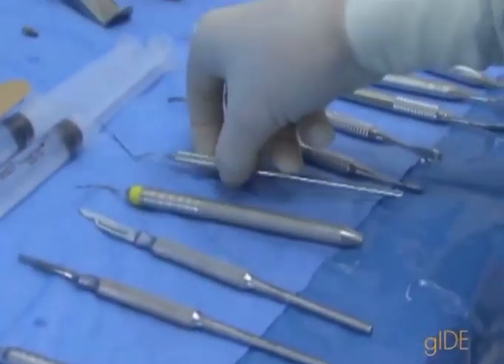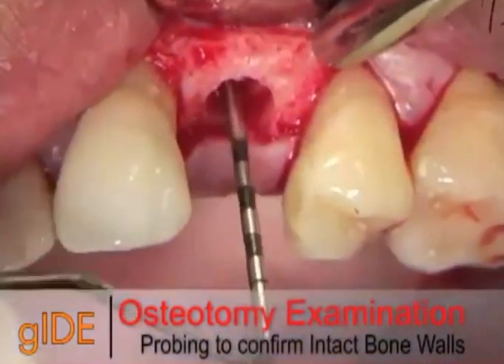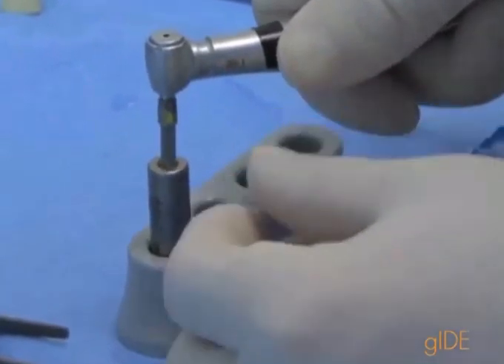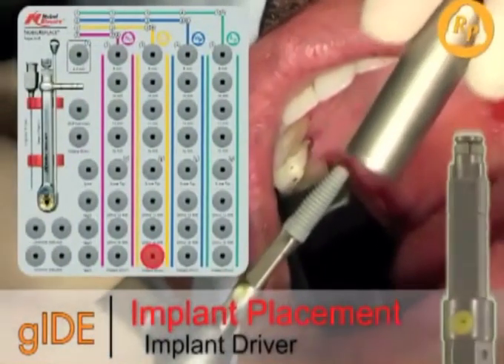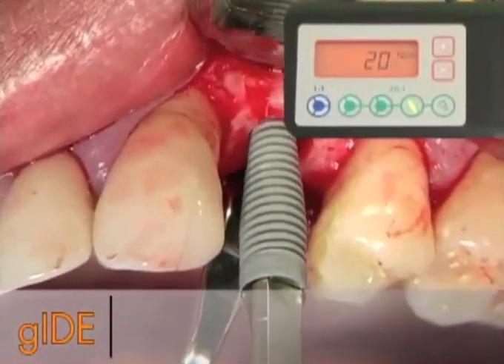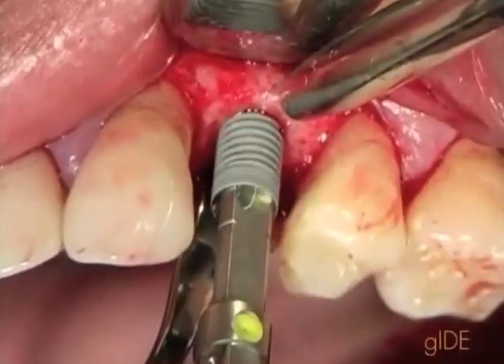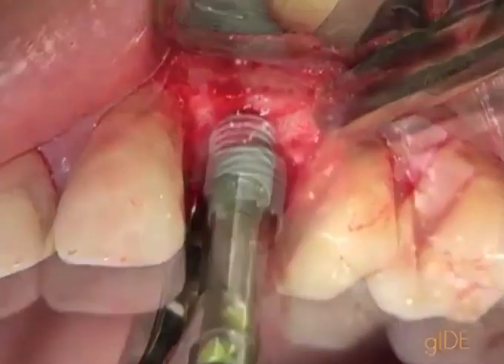An instrument is used to confirm that the bone osteotomy and the bony walls are intact and no perforations or anatomical limitations are there. Then the implant is picked up with a long shaft implant driver. The implant is pulled out of its titanium sleeve and then positioned in the osteotomy. The first torque used is 20 Newton centimeter, which will now bring the implant into position.